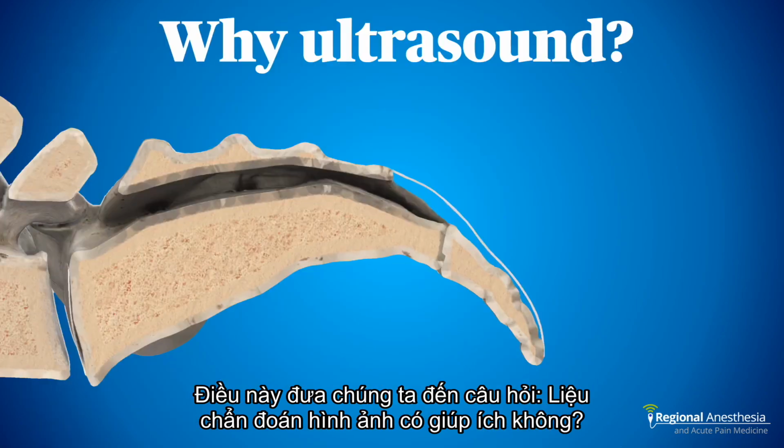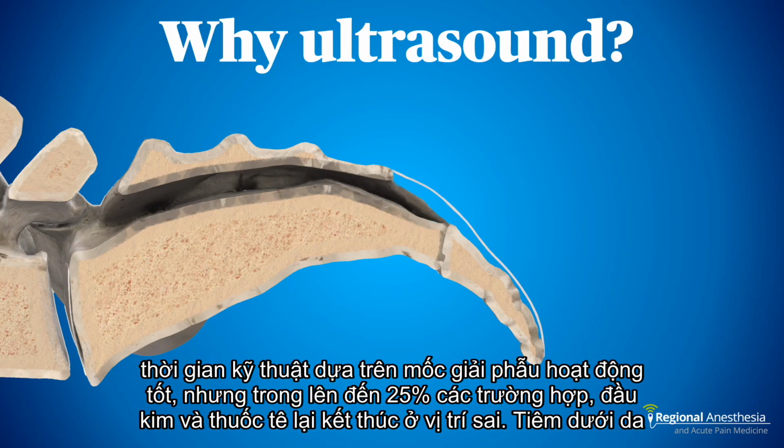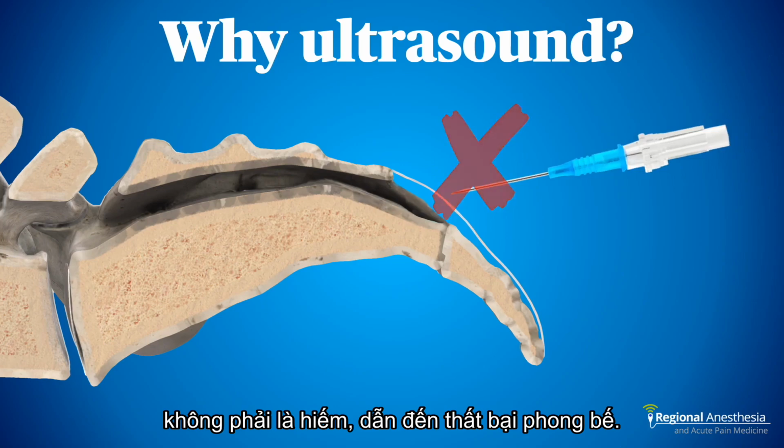Which brings us to this question: does imaging help? You betcha. Here's the issue. Most of the time, the landmark technique works just fine. But in up to 25% of cases, the needle tip and local end up in the wrong place. Subcutaneous injection is not uncommon, leading to a failed block.